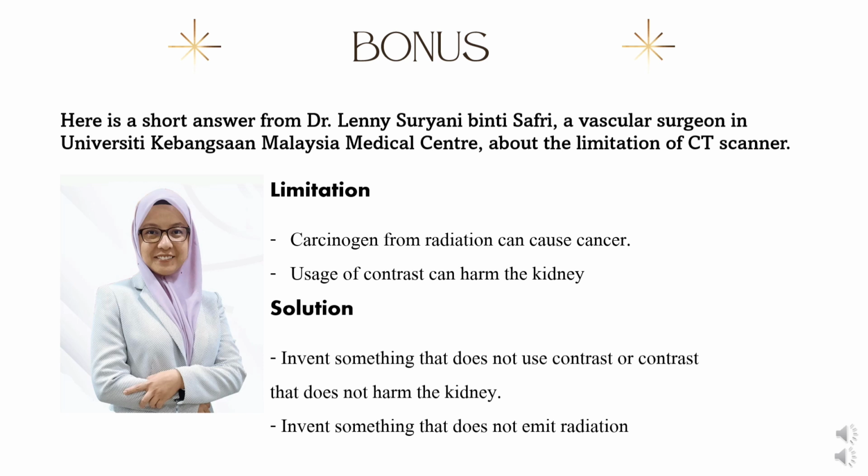CT scan, limitation, for not treatment, diagnostic. Number one, it requires contrast, so it can affect the kidney. Number two, it involves radiation, which is not good. Carcinogenic, can cause cancer. In terms of better modalities or not, CT scan is quite good compared to ultrasound. If you say MRI is better, MRI we use for soft tissue, so there is no issue of saying limitation.